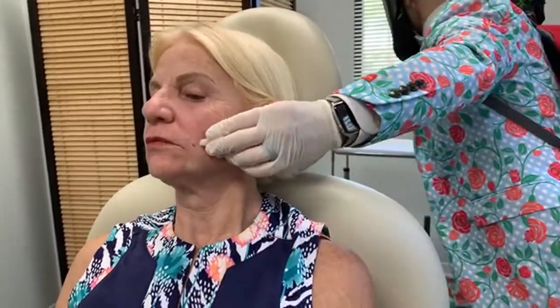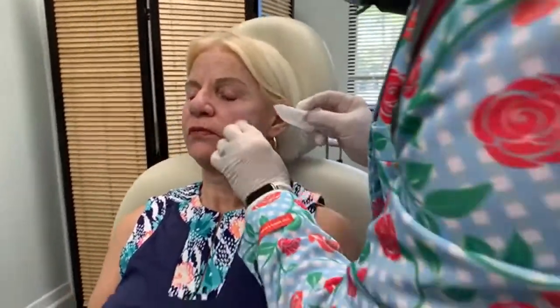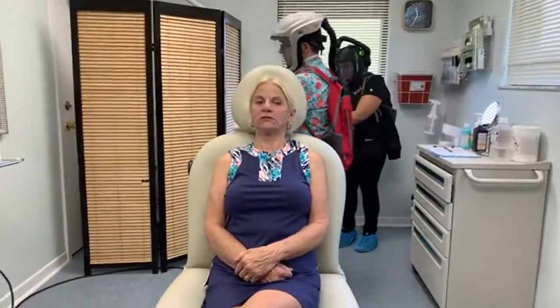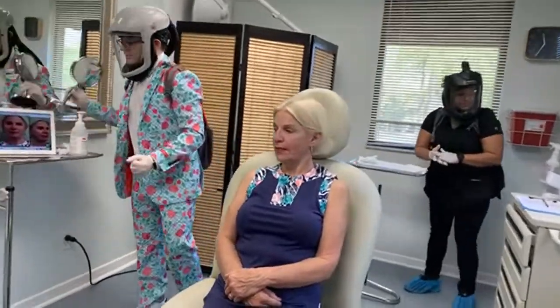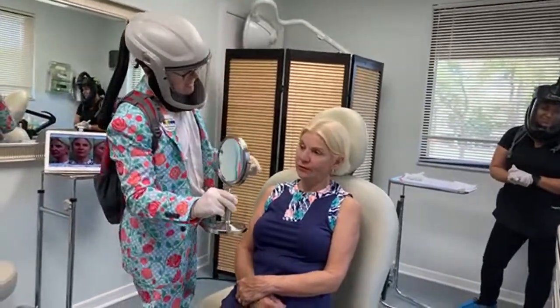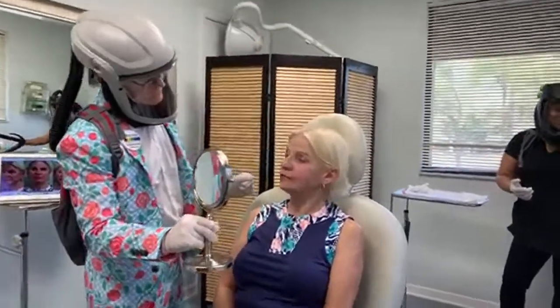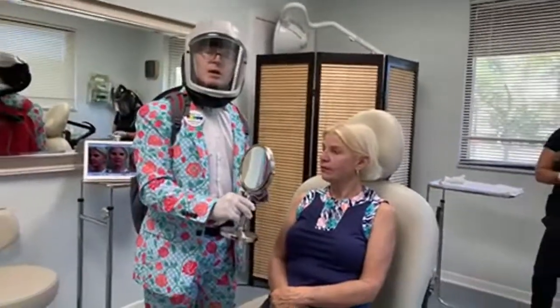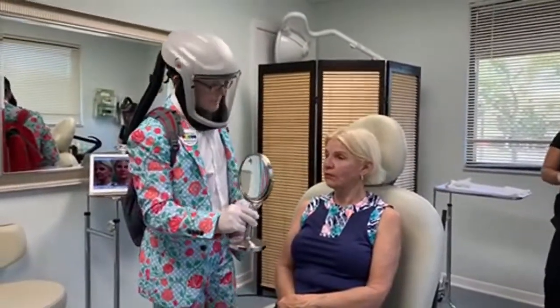Okay, so we're completely done. Hopefully that wasn't too bad. No, not at all. So even though there's a little swelling, you see how it looks good, but then the swelling is going to go down, the collagen is going to build. Can you see how it softens? Oh my gosh. You like what you see? Absolutely. A little bit of puffiness, and I'm not worried about that because we use about 6 cc's of lidocaine and almost 4 cc's of the Bellafill. So that will, now hold this for me.